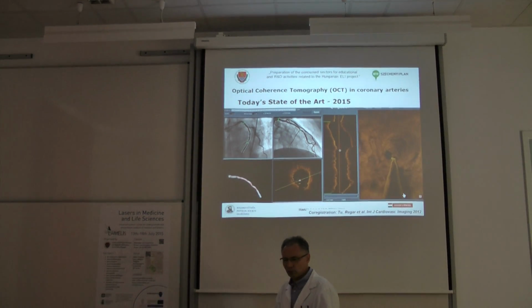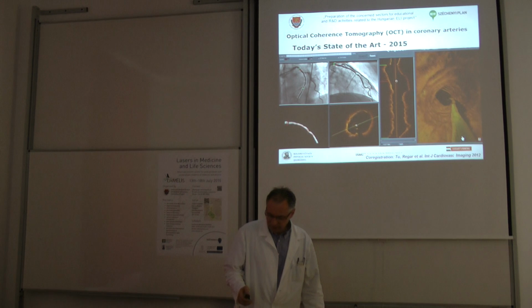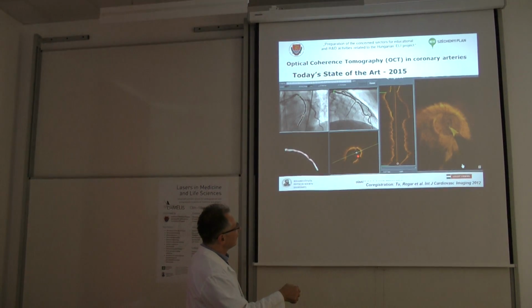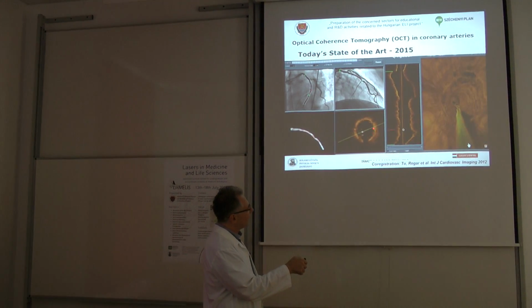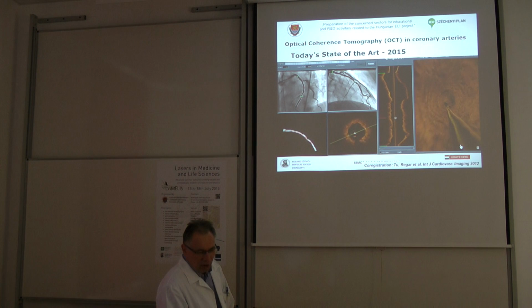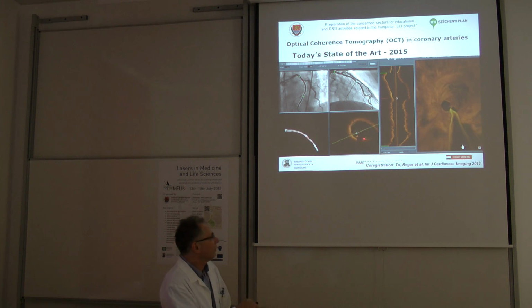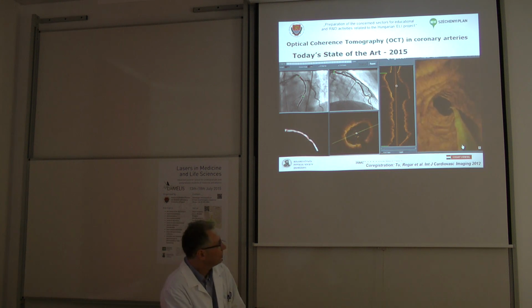the imaging probe itself. So that will always remain there as a small shadowing. Usually it doesn't prevent the general evaluation of the coronary artery itself, because it's very thin, as you can see. But it is always there. This wire is very thin. You will see it with your hands in the afternoon, but it remains there.